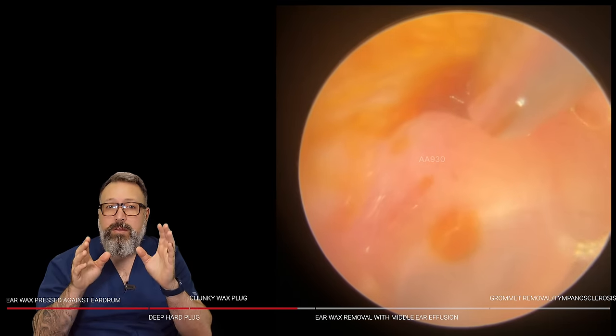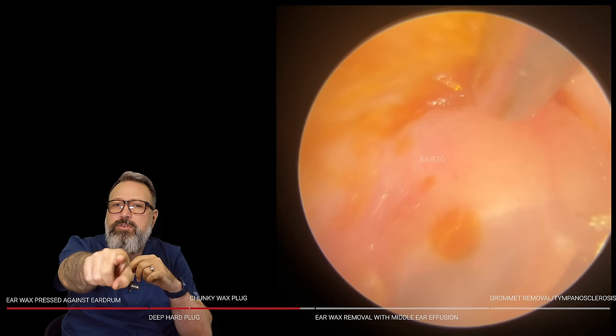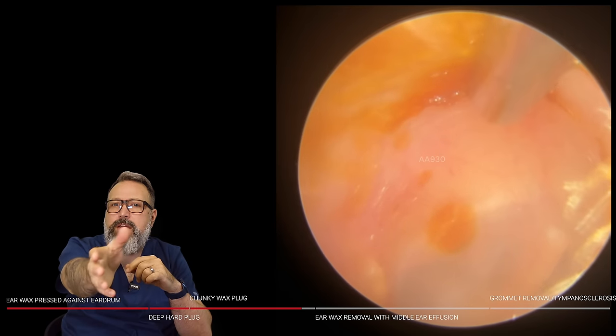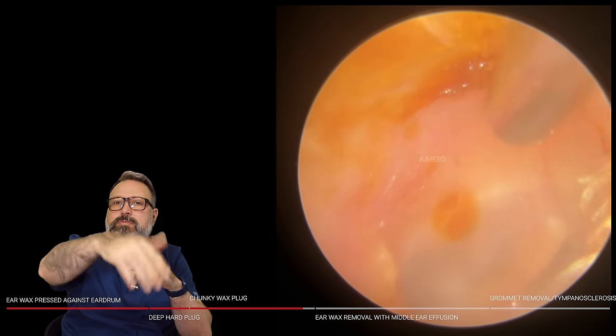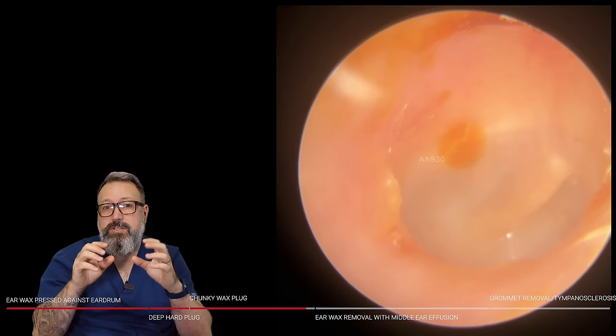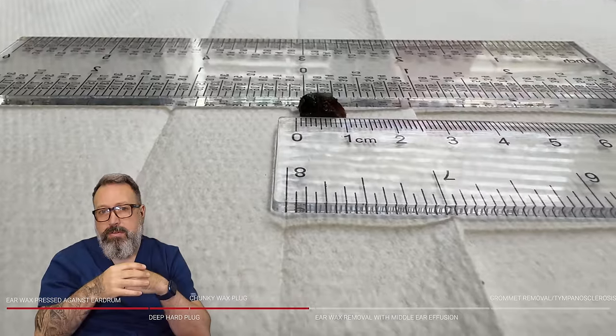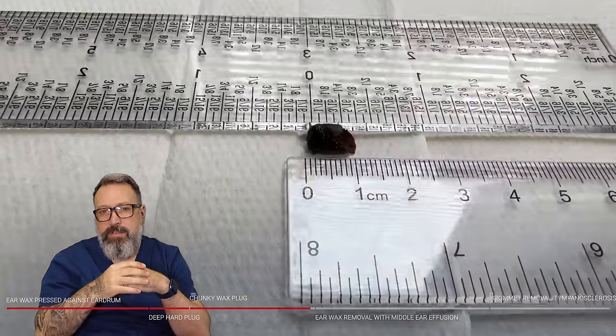Going back in for another look. There's a little brown spot you can see just in the posterior section — the posterior superior, so the back and topmost portion of the eardrum. That little section was just a bit of discolored oil; it's not wax itself, so we're going to leave that there. It looks lovely and healthy — good light reflex on that eardrum.